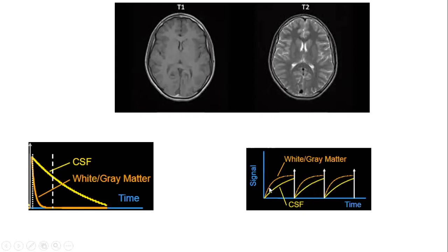If you sample the image at this point, the T1 contrast is not so pronounced, but for some it is increasing. But for a very long TR, the contrast will be reduced. So if you wait for a sufficiently long period of time, there won't be contrast due to T1 any longer. So most T1 images are captured with not so long a TR, but a shorter TR, for you to have a T1 weighted image.